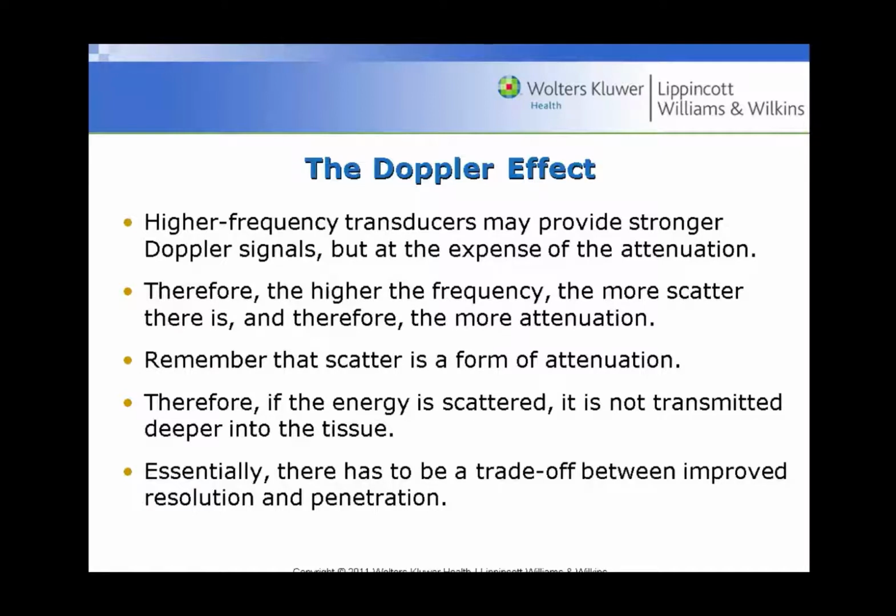While performing the Doppler effect, using high frequency transducers may give you a stronger Doppler signal, but remember, you're going to lose to attenuation. Higher frequency is like our sprinter, and you're going to lose the energy very quickly, so it will not be able to go deep into the body. So just remember that you may have a trade-off between improved resolution and penetration, and this is a trade-off you're going to have to make all the time. But again, because you're using higher frequency, you're also going to have more scatter, and scatter is a form of attenuation.